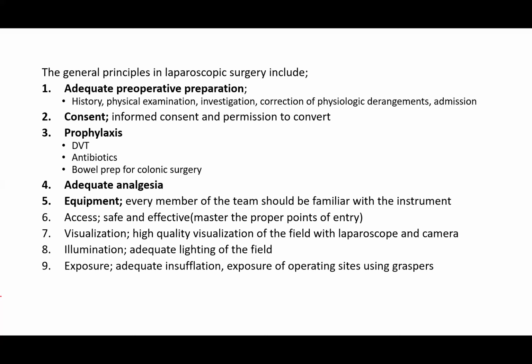So the exposure: there should be adequate insufflation. Now, if your ports are faulty and they keep on leaking, you are going to suffer in that procedure. If you have ports that are leaking and you proceed with the surgery, you'll be wasting CO2, the abdomen will be collapsing, and the entire procedure will be unnecessarily too lengthy.